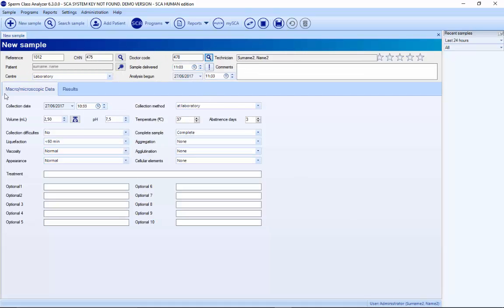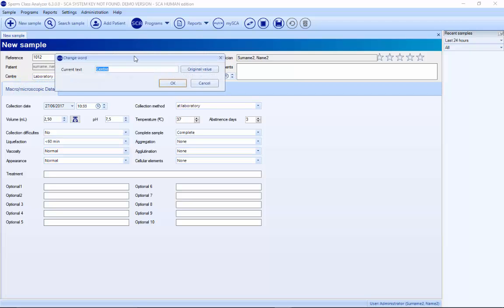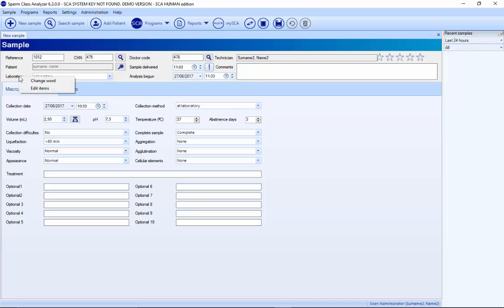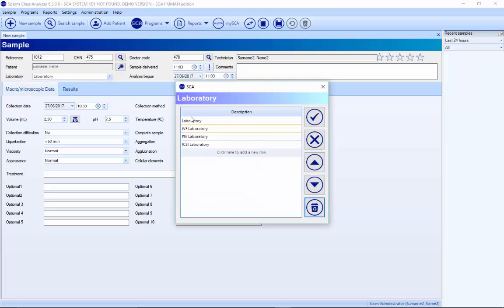In the main window, you can customize these properties. For example, if I don't want 'center', I want 'laboratory' instead — I just go here, write 'laboratory', and it changes automatically. It's also possible to customize the different dropdown settings by right-clicking, selecting 'Edit items', and changing whatever you want — for example, writing 'andrology', and you can add, delete, or change the order of items.